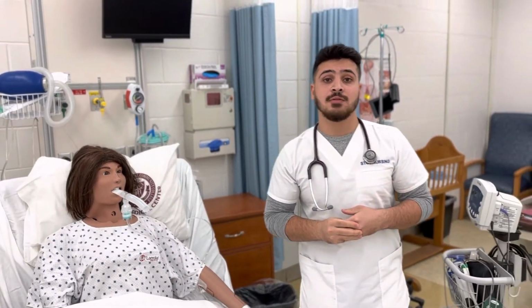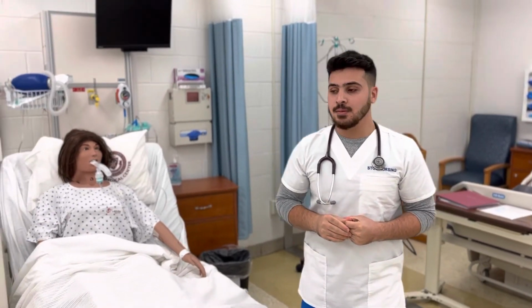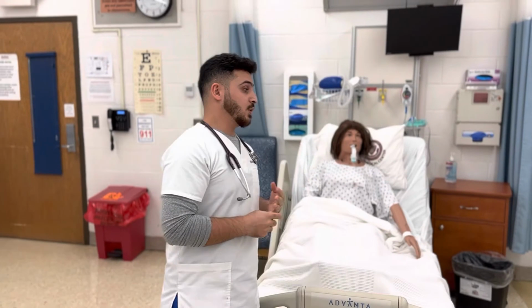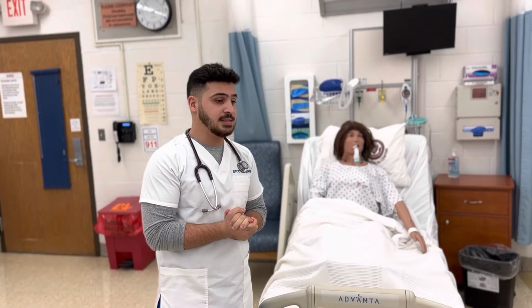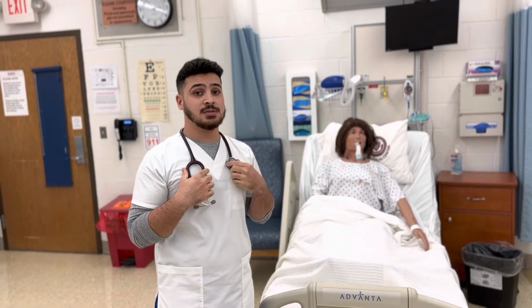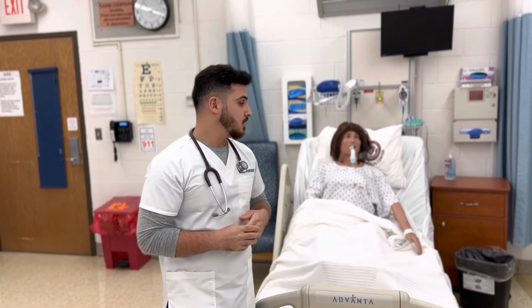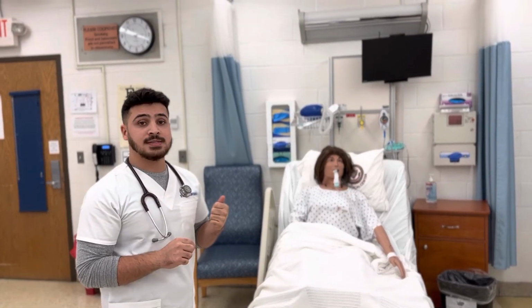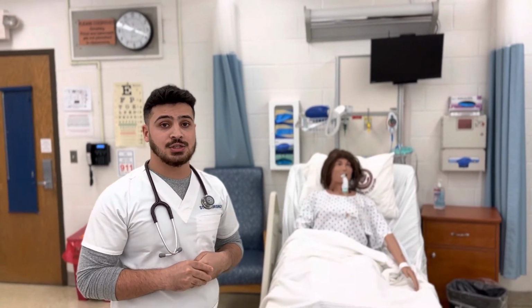Now you have learned how to administer a nebulizer treatment. It's very important to follow these four steps: infection control by washing our hands for at least 20 seconds, assessing the lung sounds and oxygen saturation, preparing our items by connecting the oxygen tube to the nebulizer device and the oxygen tank, and educating the patient on how to use the nebulizer treatment.